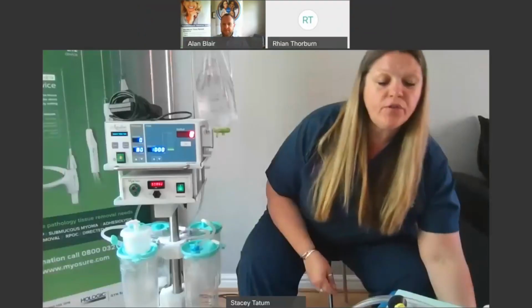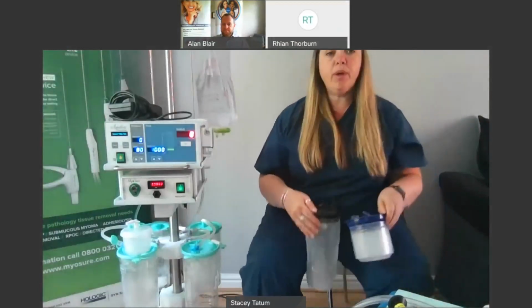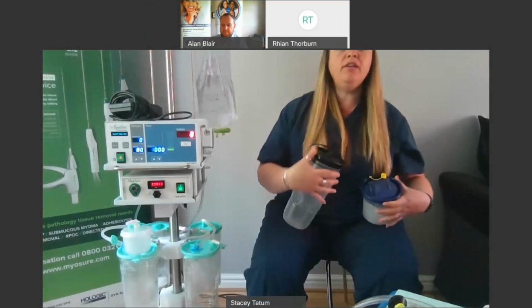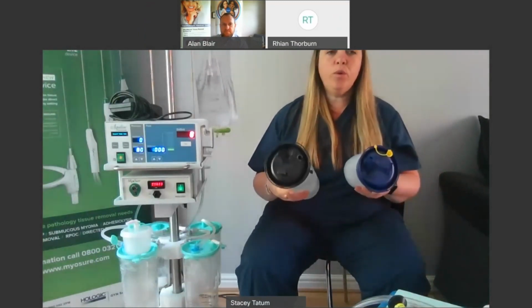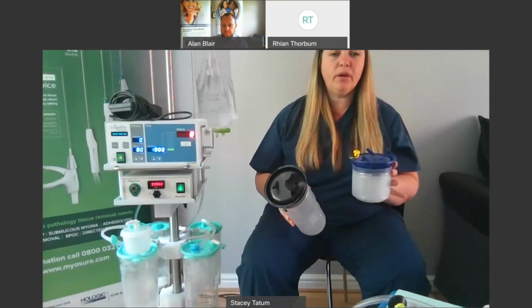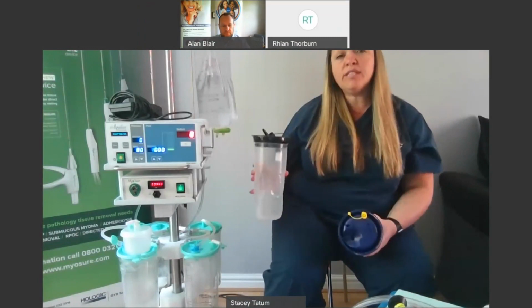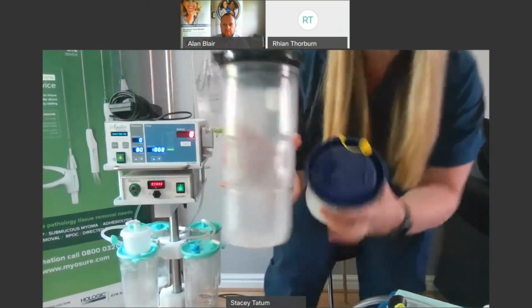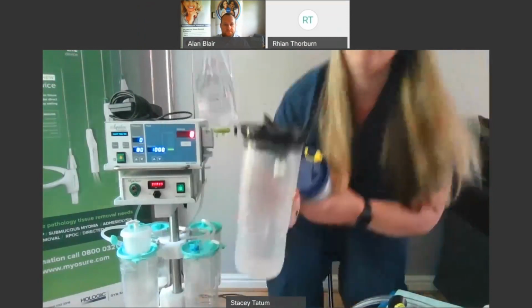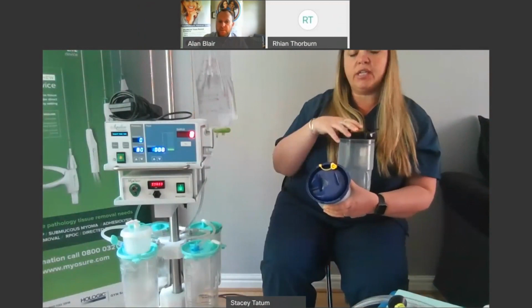Thanks, Alan. So for those that are using VACSAC, it's the same principle. You have 4 canisters, 2 at the front, 2 at the back, but your liners will be different. So with the VACSAC, you have 2 coloured liners. You have a black liner and a blue liner. The black liner always goes at the back, and that is because inside the liner is a filter, and that filter is going to stop any fluid coming back and up to the machine.